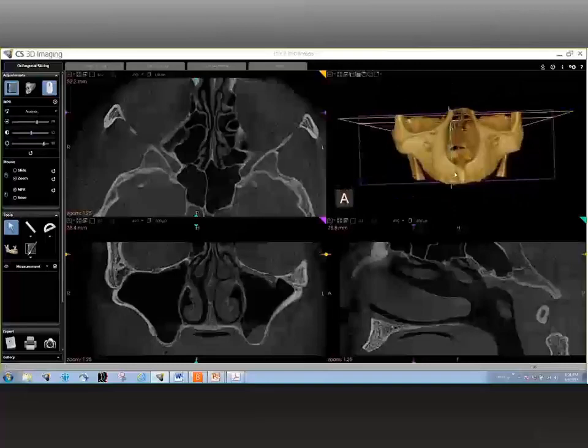So by understanding the sinus health, you are able to make sure that you are treating the right disease of the jaw. So, of course, with diagnosis being of utmost importance, you're trying to bring attention to the fact that some of the diseases of the maxillary jaw can be mistaken for sinus disease or vice versa. That is correct. That is absolutely correct.